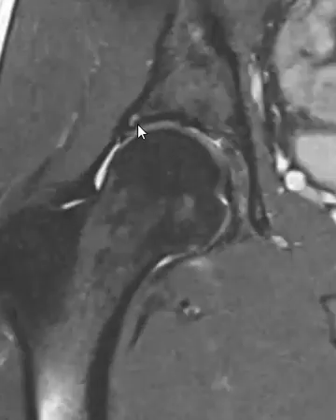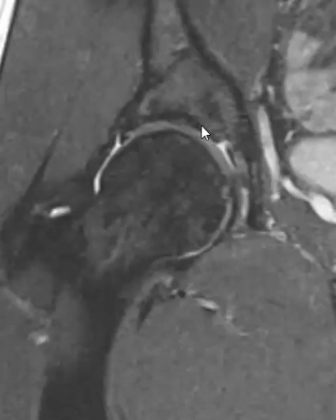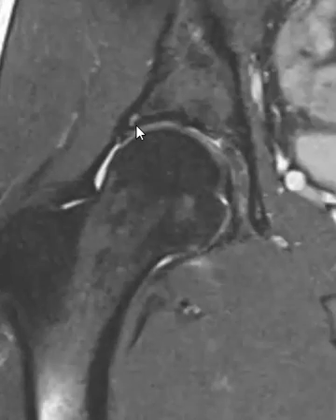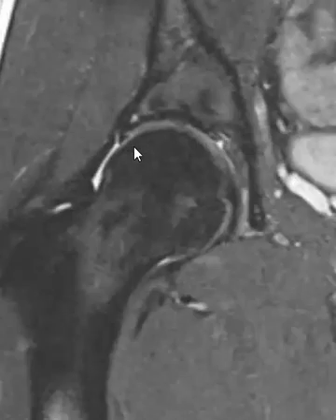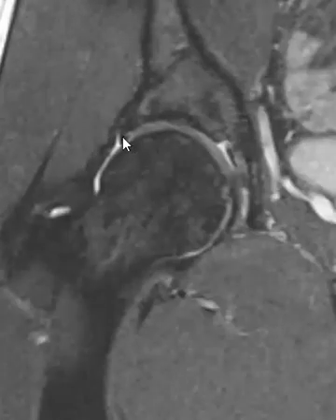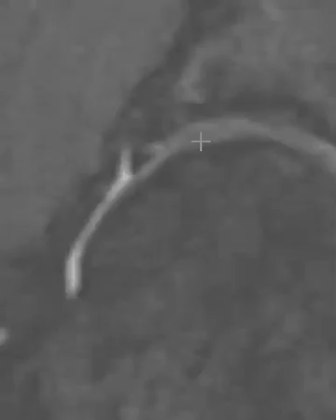In this patient there's a little area of brightness here within the cortex — this is the acetabulum part of the ilium — and this black line is the cortex. There's a little tiny cystic erosion in the cortex. Right next to the cortex is a little black triangle here — this is called the hip labrum. The hip labrum is a little fibrocartilaginous ring that goes around the rim of this cup, and this patient has a very small horizontal tear within the superior labrum. Normally we should see darkness going all the way up to the edge of the bone, but instead we see a little area of transverse brightness, which represents a really tiny tear — hardly ever seen this small.